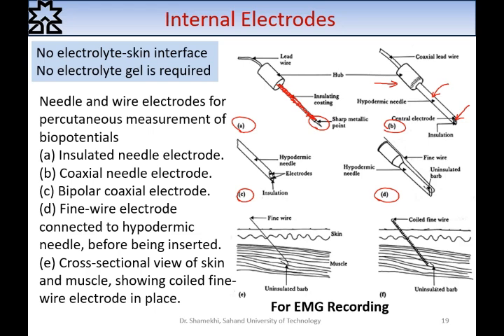Okay, the third one is bipolar coaxial electrodes.